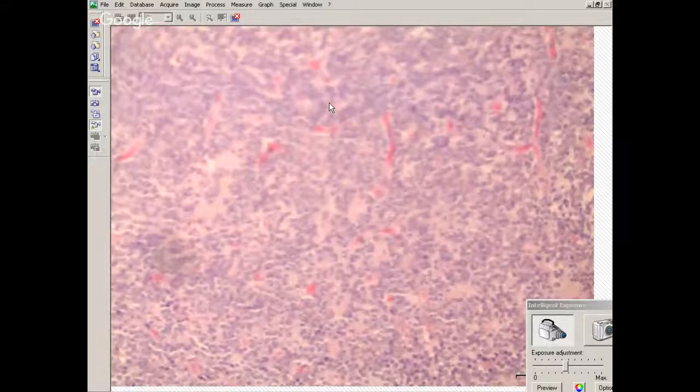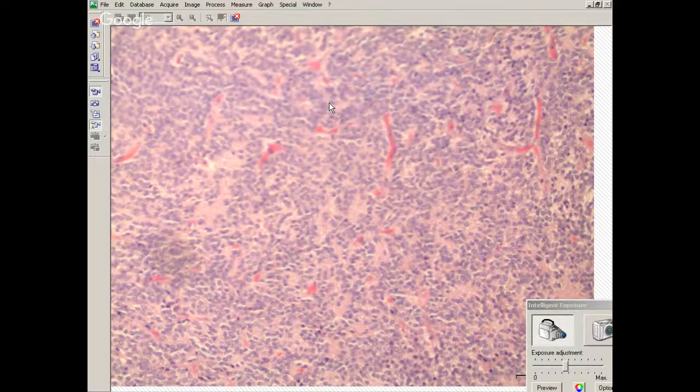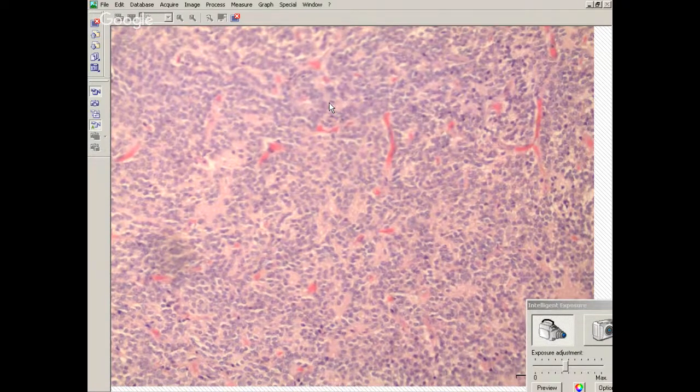Okay. And the main difference between neurocytoma and ependymoma is its location. Although you can't always tell, if you have a huge tumor in the ventricle, then it could be an ependymoma, it could be a neurocytoma. But typically in an ependymoma, anywhere that there's fibrillary processes, you typically end up having a blood vessel in the center of an acellular fibrillary zone, and around that fibrillary zone are uniform cells. So they can look very similar. Sometimes an ependymoma will have true ependymal rosettes where they have an actual lumen and microvilli lining the lumen, trying to recapitulate an actual ependymal lining. But this is actually a neurocytoma.